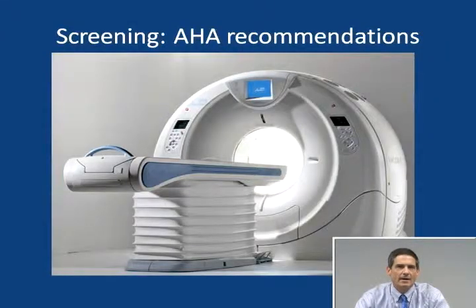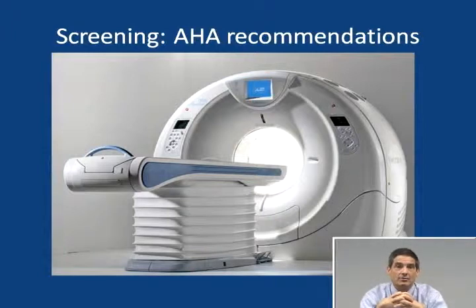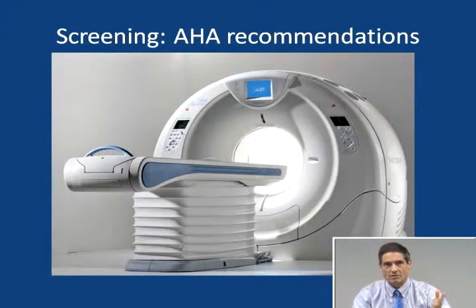At present, there is an imaging method, coronary artery calcium scoring. This method uses the same CT technique, with EKG gating and no IV contrast, and you calculate the amount of calcium in the coronary arteries. More calcium in the coronary arteries means a higher likelihood of significant plaque, a higher likelihood of rupture, and a higher likelihood of a cardiac event, either an MI or death. The calcium scoring actually predicts all-cause mortality quite well, better than the other method of serum cholesterol and an equation.